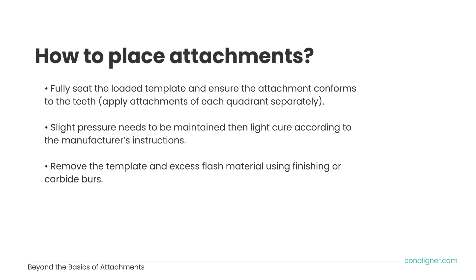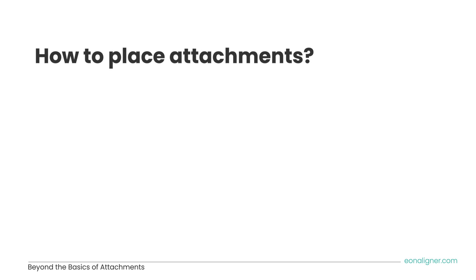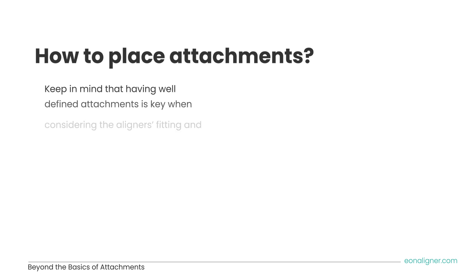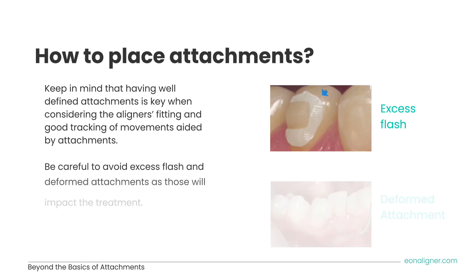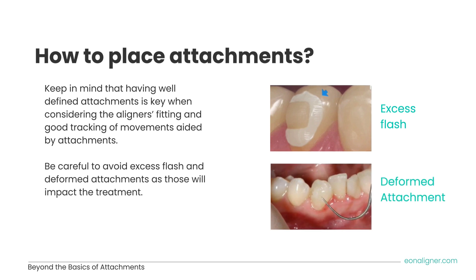Remove the template and excess flash material using finishing or carbide burrs. Well-defined attachments are key for good aligner fitting and proper tracking of movements. Always check and avoid excess flash and deformed attachments, as those will impact the treatment.